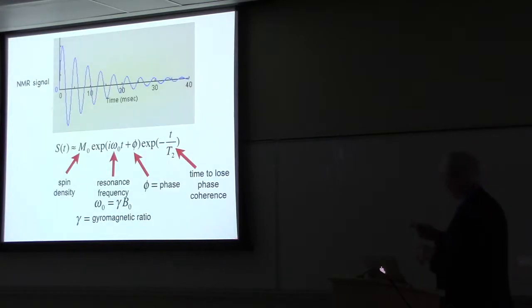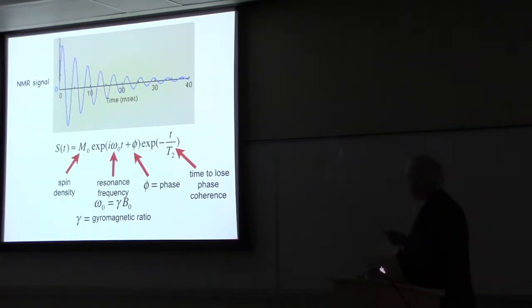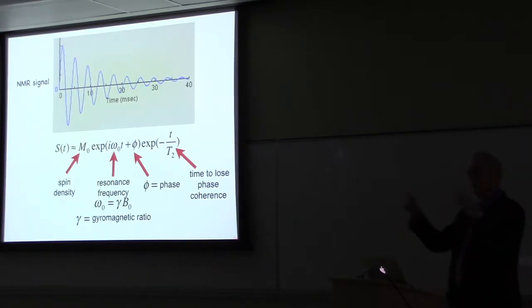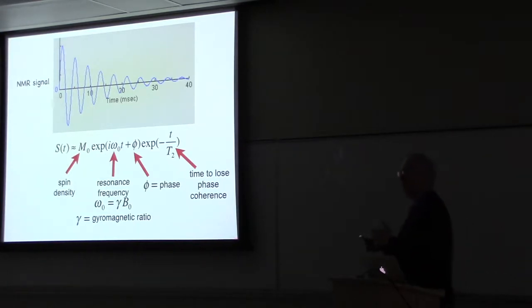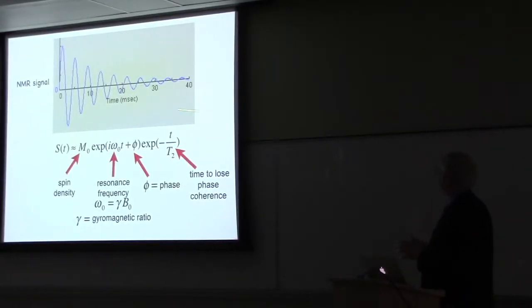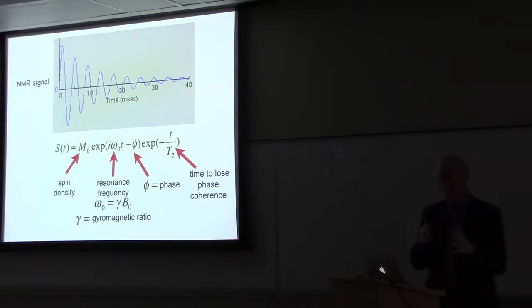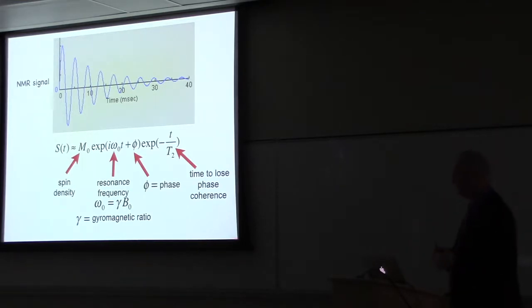Here it is, whoa. So this is the signal that you induce. It's oscillating at a frequency that depends on the resonance frequency, that depends on the field, depends on how many spins you have. It also decays with a time constant, normally written as T2 or T2 star, because gradually over time that whole phenomenon kind of gives up and you lose what's called phase coherence. The spins relax back to equilibrium until your signal goes away. And this is one of the time constants that people measure sometimes, and they use that to vary the contrast in an NMR image.